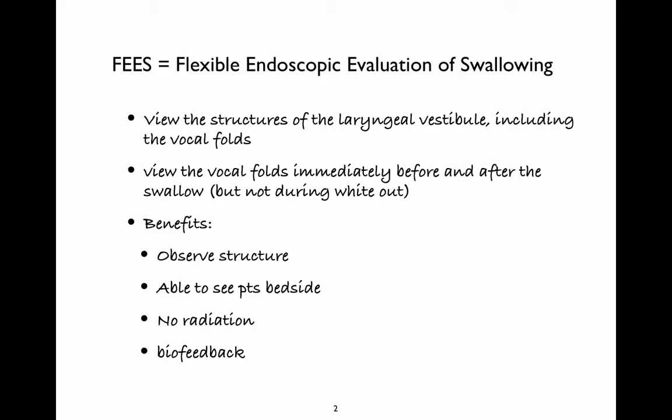FEES stands for Flexible Endoscopic Evaluation of Swallowing. Now, when you do a FEES examination, you are taking an endoscope, that same endoscopic technology that's used to evaluate phonation and voice disorders, and you are passing the scope transnasally through the nares, up and over the soft palate, such that the light and the camera in the endoscope are hanging down and can view the surface of the vocal folds.